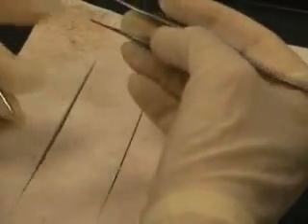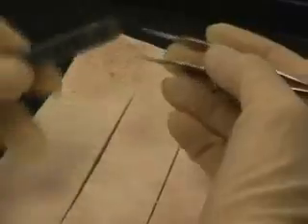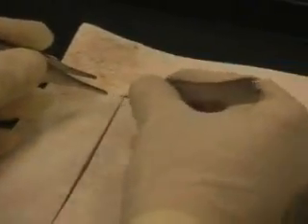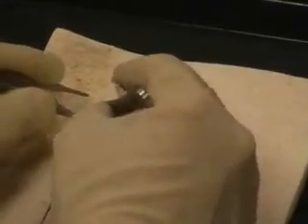If you notice really carefully, I'm not sure if you can see this, but there are 2 teeth and 1 tooth on these little Addison forceps. This one happens to be smooth and doesn't have teeth. But the idea is you don't want to grasp the tissue so strongly that you're leaving little marks. You want to just really try to hold the tissue up as best you can. With the pig, you are going to have to squeeze a little bit, and it is difficult to evert.